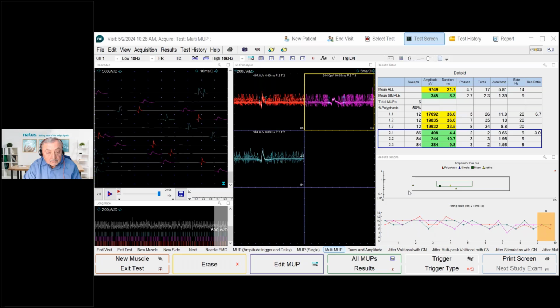Okay, thank you. This last question, with respect to time: when will this version of software be released? Elite 2 is released. Yes, that's right. So it is released, so you can certainly take advantage of all the new features. And I think that's all for the questions we have.